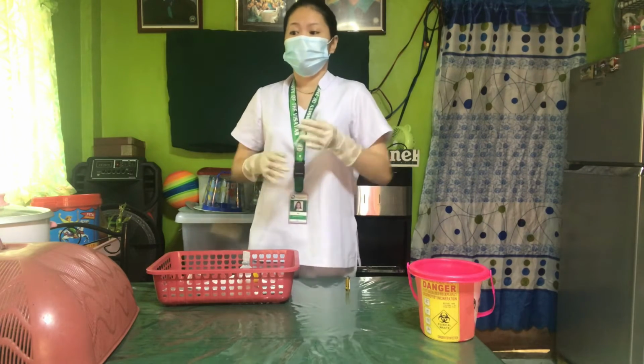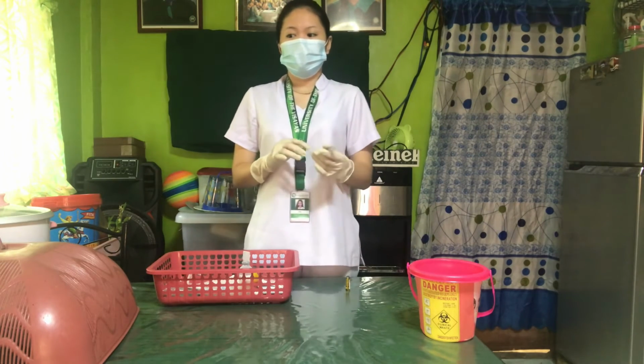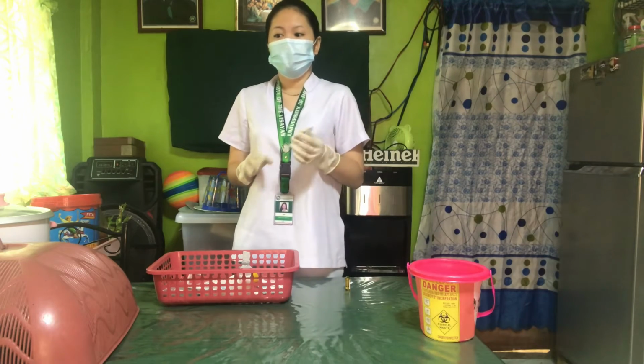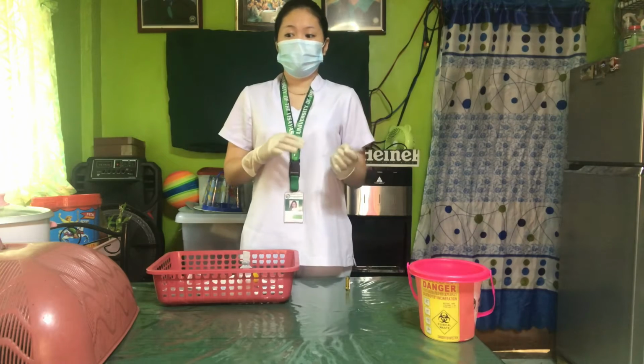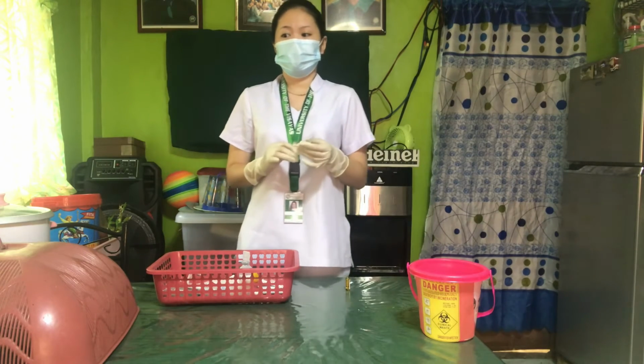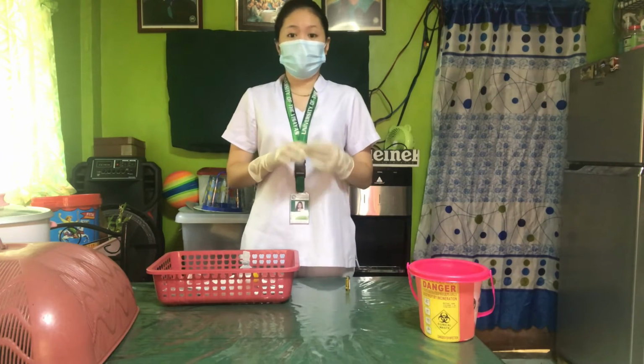Next is place the filter needle, tighten up the cap at the hub of the needle and push solution into the needle to the prescribed amount using the original needle of the syringe.